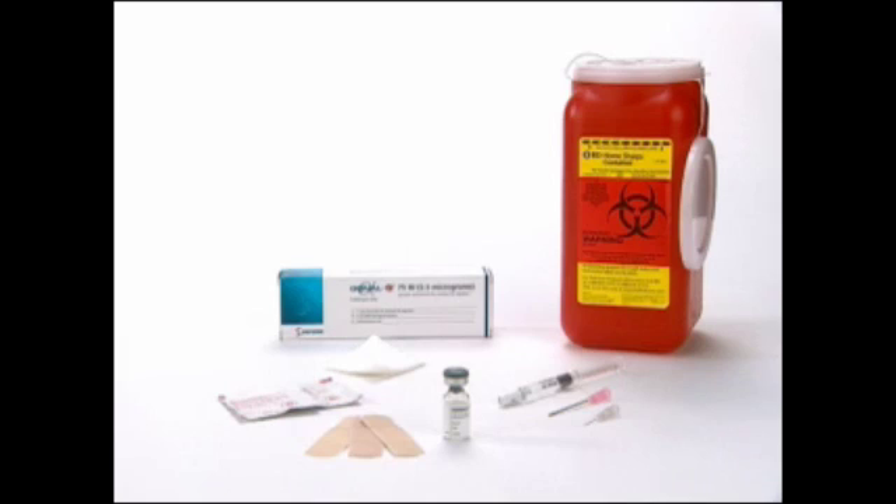Be sure to have all of the following items before you begin: Gonal F RFF 75 IU Powder Vial; Pink Mixing Needle, 18 gauge, 1½ inch; Gray Injection Needle, 27 gauge, ½ inch; Pre-filled syringe labeled Sterile Water for Injection, USP; Alcohol swabs; Sterile gauze pads; Safety Container.